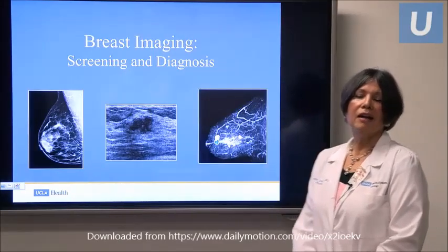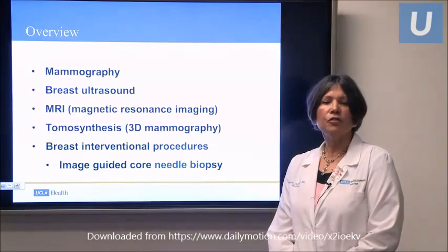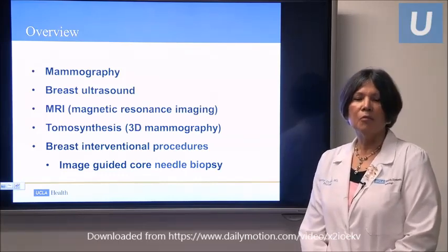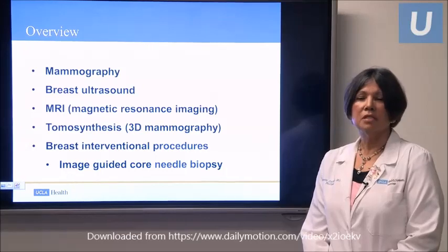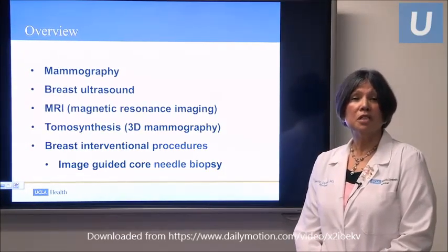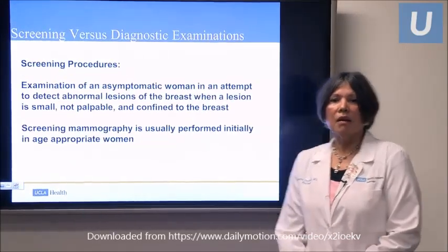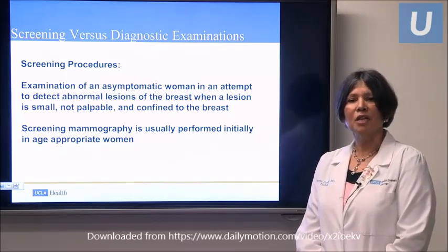Just going to talk about breast imaging and screening and diagnosis. I'm going to have an overview of the tools that I use: mammography, breast ultrasound, MRI, which is magnetic resonance imaging, tomosynthesis, which is the new 3D mammography, and talk about some of the breast interventional procedures that we do with the image-guided biopsies. I want to first discuss the use of screening versus diagnostic examinations.